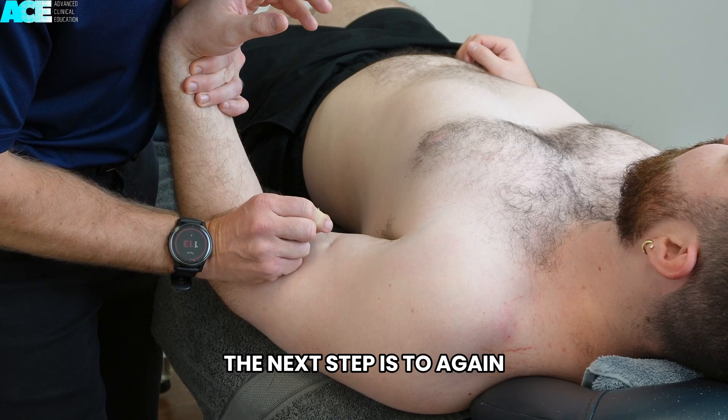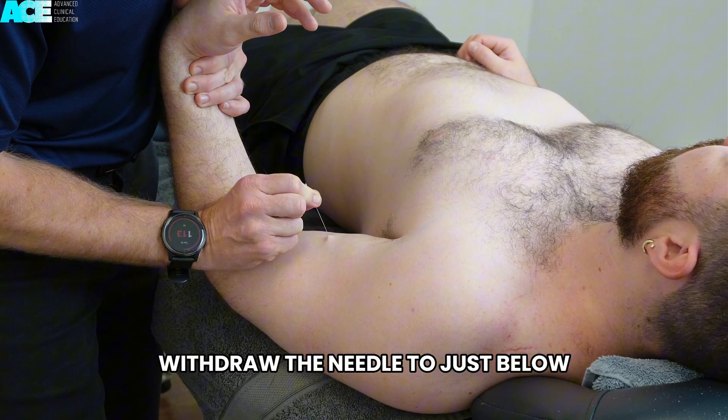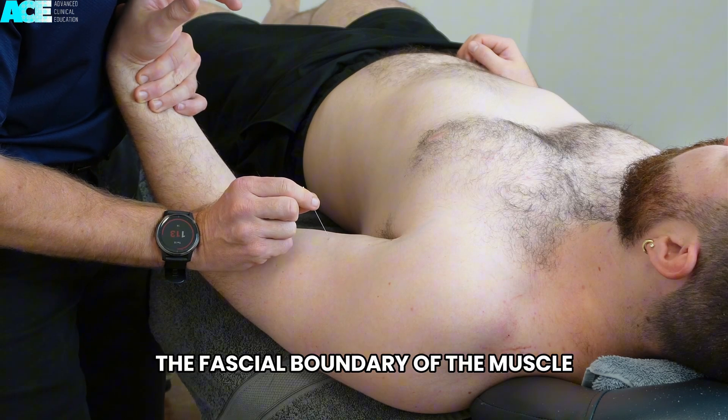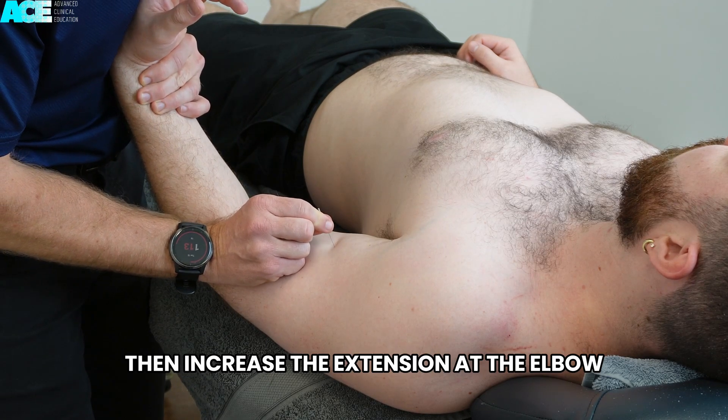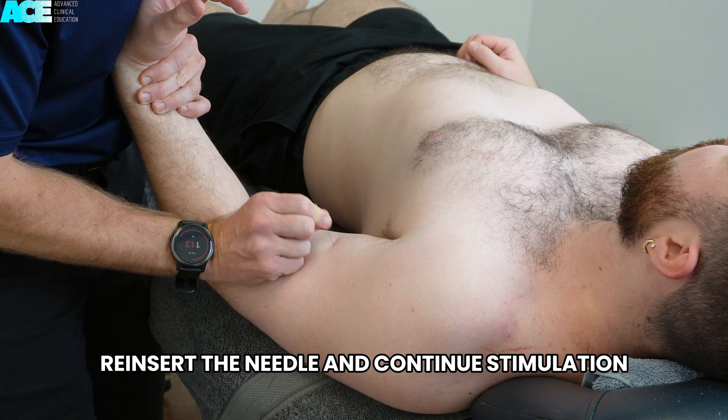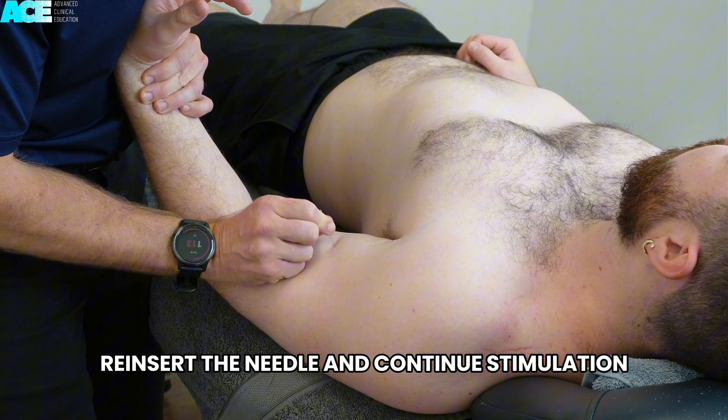The next step is to again withdraw the needle to just below the surface of the skin, making sure that you are beyond the fascial boundary of the muscle. Then increase the extension at the elbow, reinsert the needle, and continue stimulation.